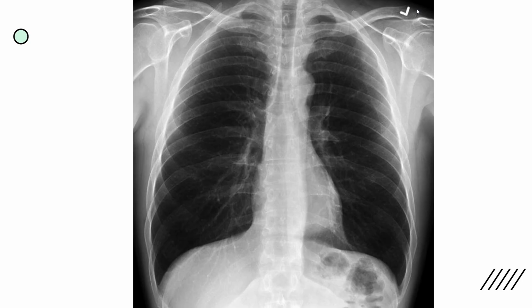The only thing that I would say on this one is that the left marker is overlying anatomy. Although we're not looking at the clavicles, radiologists are required to report on anything that they see in the imaging. So even if we're taking this for the chest, which we are, they are not going to like it that there's a marker overlying anatomy that they're supposed to talk about. So it'd be best if it were up in the corner in that airspace that we're not evaluating.